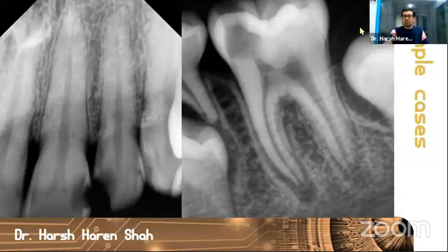So let's start with a few different cases here. The first thing that we are seeing is how you tackle simple cases. Now, there is often a possibility that you will not have any difficulty in the procedure. When you see radiographs like this, you are pretty much sure that nothing is going to go wrong. This is going to be a straightforward case. And there are basically two ways to assess this difficulty, especially when you talk in terms of glide path.